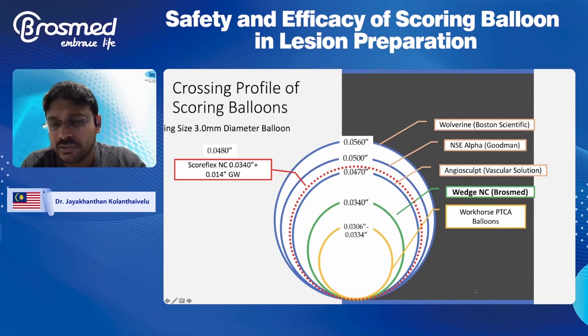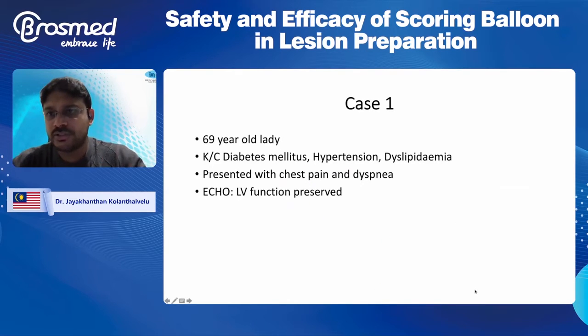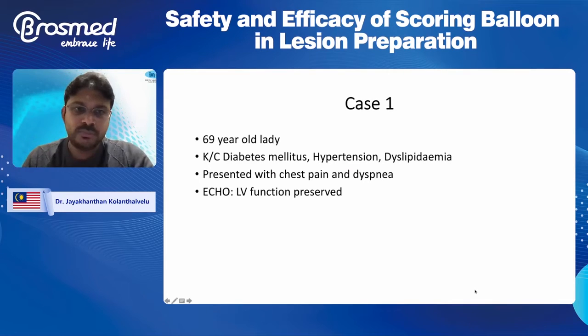And you're able to deliver it to a little bit tortuous lesions, distal lesions, with not much effort. So I would like to share a few cases just to illustrate what I've been talking about. Feel free to stop me at any point to ask me any questions.